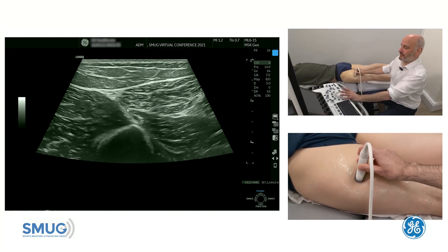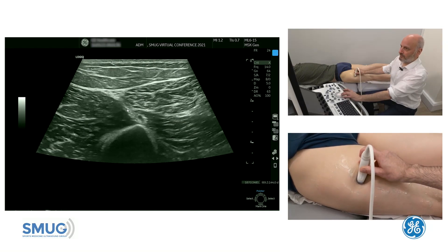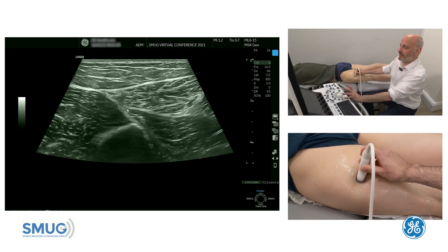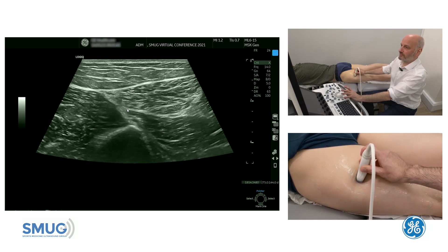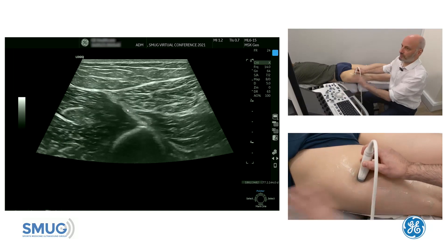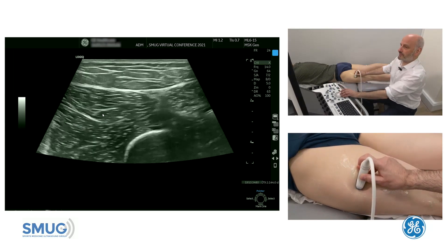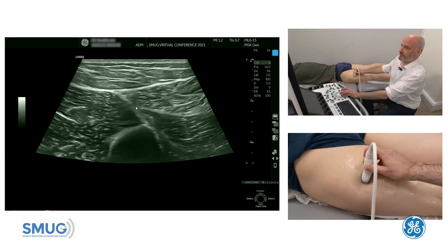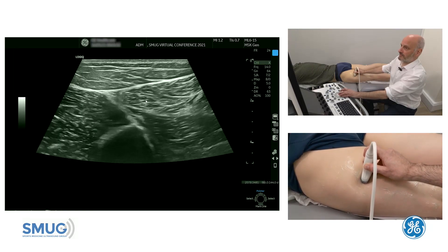Let's go over how you assess and find the T-junction. We normally try to approach it in a systematic way, which means we need to identify the short head and long head of the biceps. To do that, we start quite proximal where we have on the lateral side a lateral compartment, and we identify the fascia between the lateral compartment and the posterior compartment.